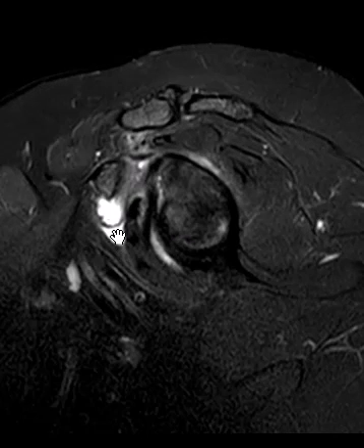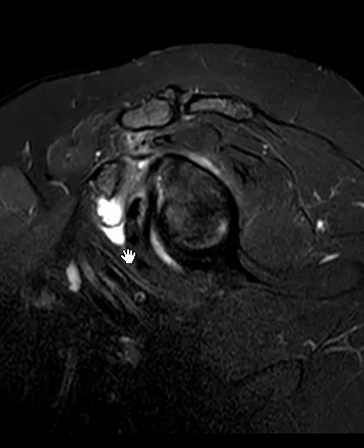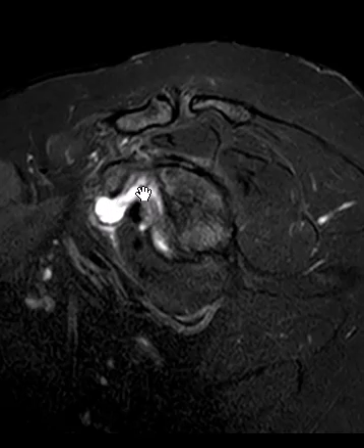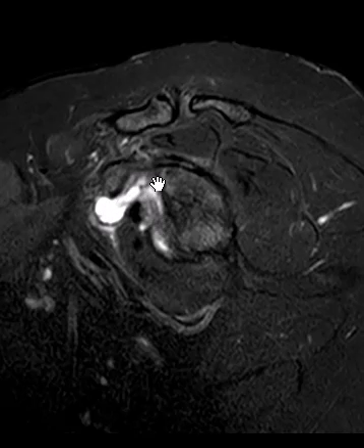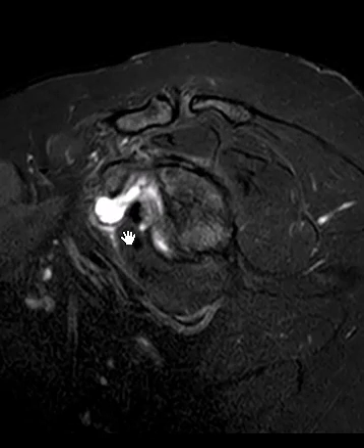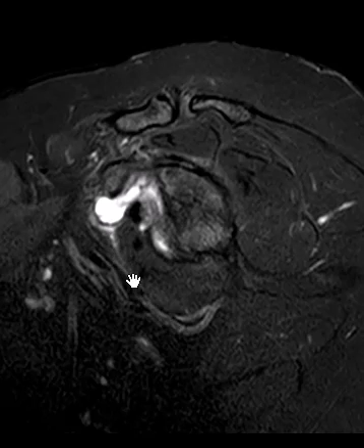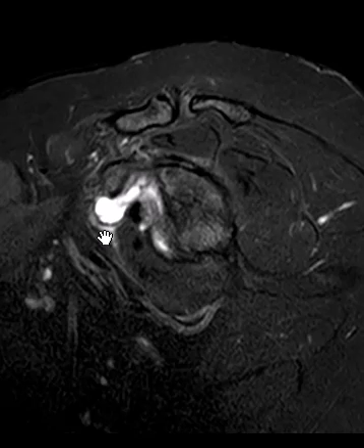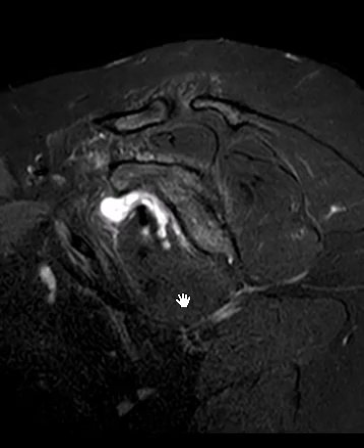Now you'll note there's a little bit of fluid underneath that, and this little fluid collection may be within that subcoracoid bursa. But if you see fluid that's communicating with the joint and hangs over it like a saddlebag, that's a recess called the superior subscapularis recess. If you see it not communicate with the joint and hang down here lower along the front of the subscapularis muscle and beneath the coracoid, that's fluid in the subcoracoid bursa, or subcoracoid bursitis — that's much, much less common.